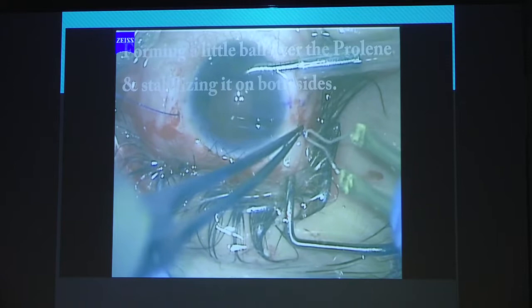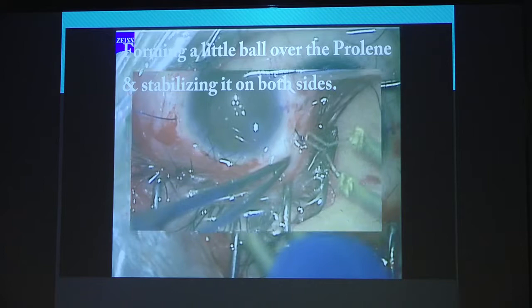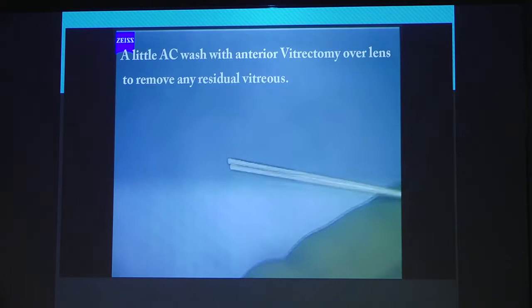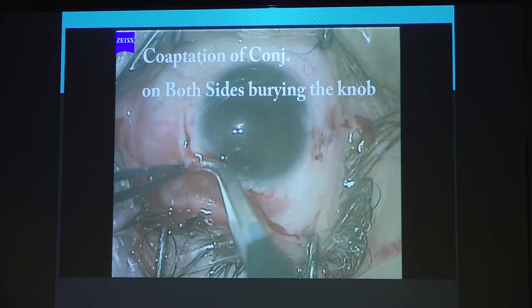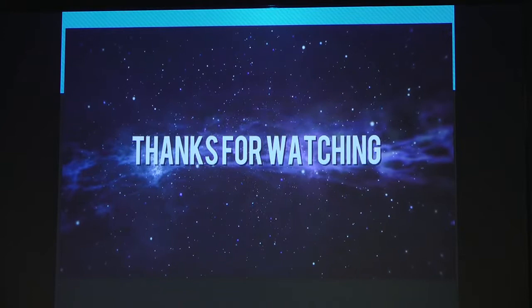For the last part, put it with the forceps behind and use this low-heat cautery — you create a ball, and that is it. Now comes the next part: use a vitrector to remove any residual vitreous which is lying on top, because there has to be vitreous — you are bathing yourself in it. After that apply a little steroid to make sure the vitreous is completely off. Then take your conjunctival flap which you cut — remember you cut those two little conjunctival flaps — use a coaptation forcep and close up your conjunctival flaps. So you have now got done. You have managed to put in a lens, irrespective of what type of dislocated lens. This is the easiest way to do it; anybody can do it — if I can do it, anybody can.